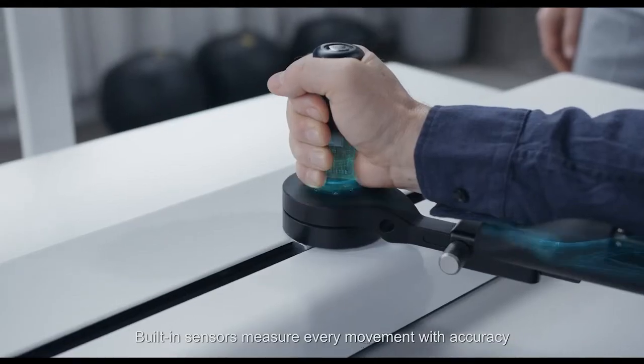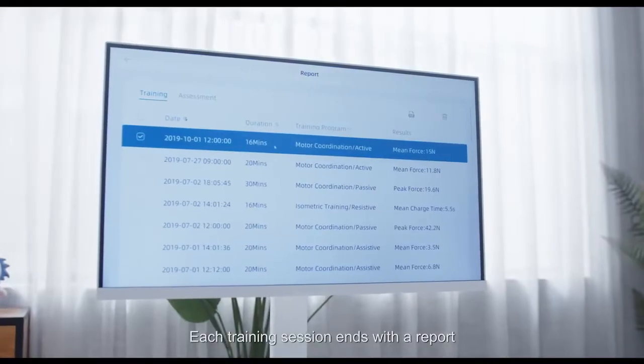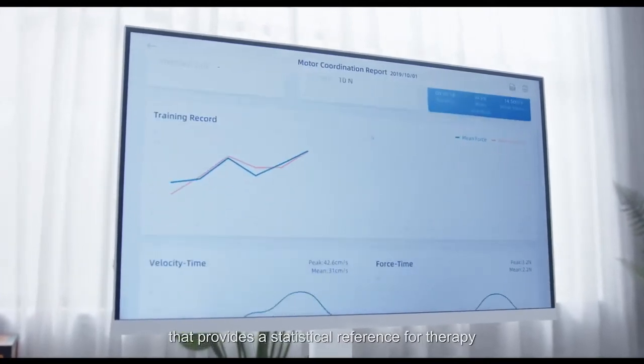Built-in sensors measure every movement with accuracy. Each training session ends with a report that provides a statistical reference for therapy.